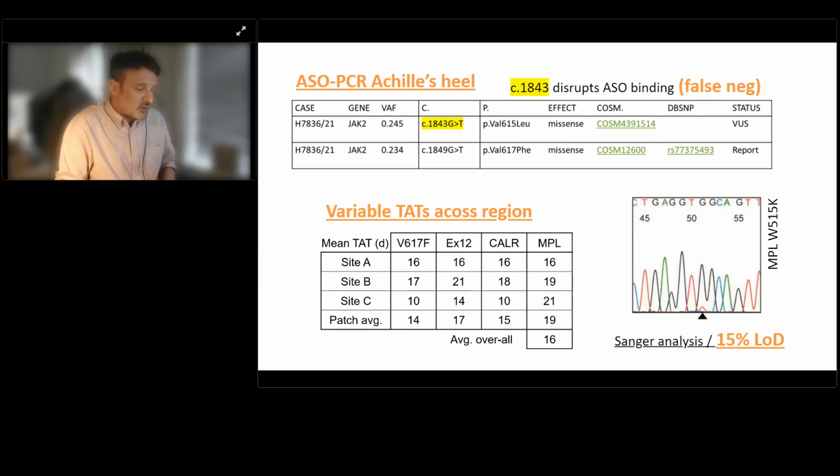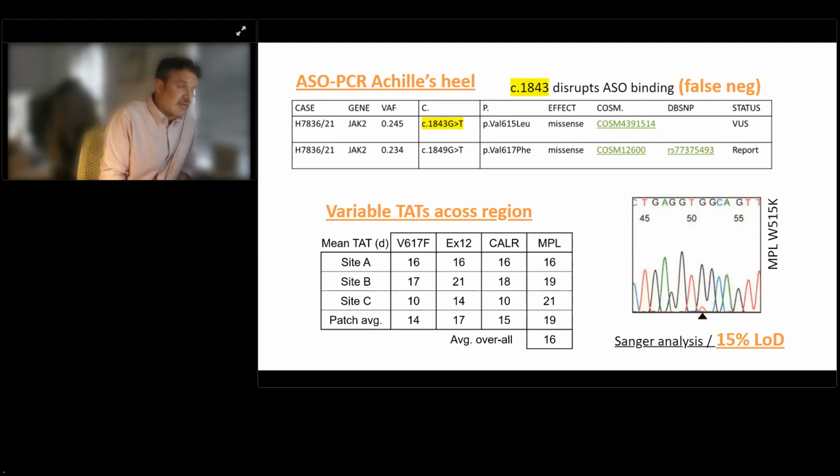Additionally, because we had multiple sites performing multiple tests, we had disparate turnaround times for the patients, and because some of those tests sequentially would require different tests, like Sanger sequencing for MPL, for example, that meant we had different turnaround times and different limits of detection. So the patients potentially with the same disease, but a different mutation, would have a different time to diagnosis, and some would require bone marrow biopsies to enhance the sensitivity of the testing strategy. So it wasn't without its flaws.